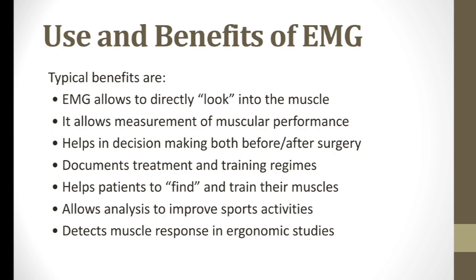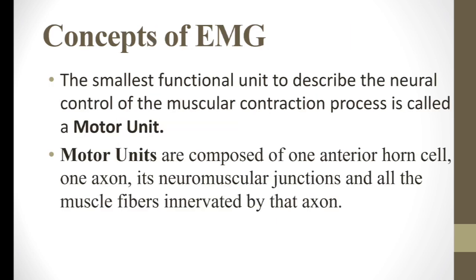So what are the uses and benefits of EMG? It allows to directly look into the muscle, measurement of muscle performance in decision making both before and after surgery, document treatment and training regimes, help patients to find and train their muscles, allow analysis to improve sports activities, detect muscle response in ergonomic studies.